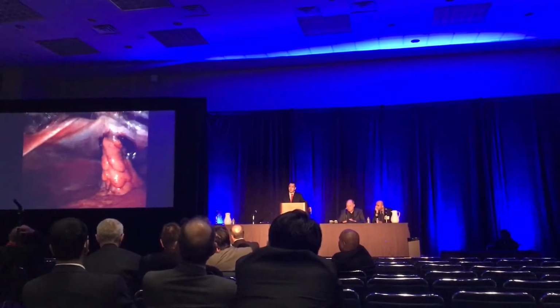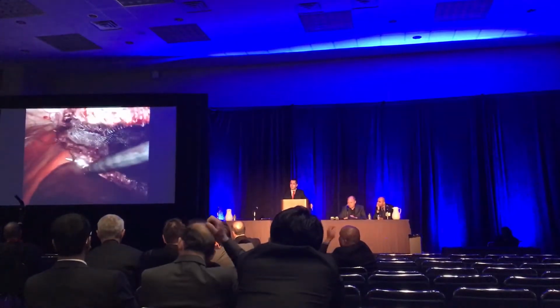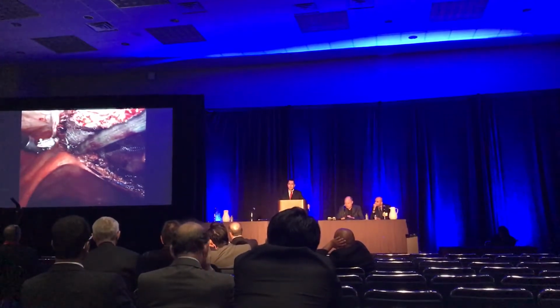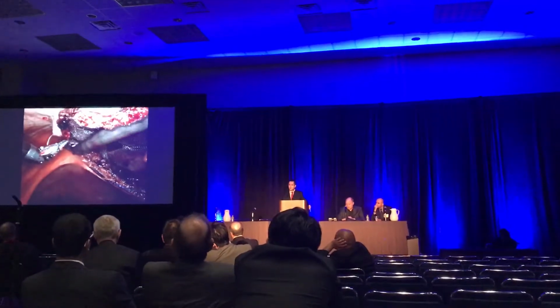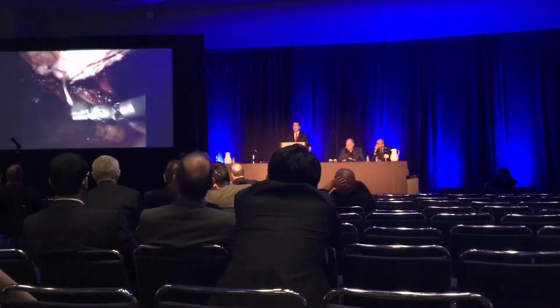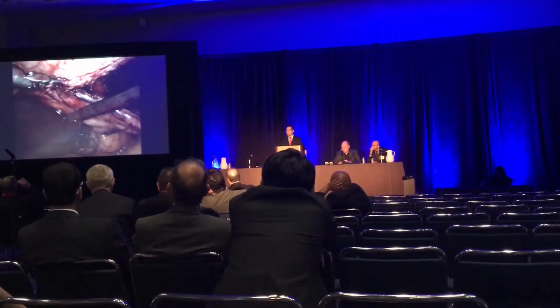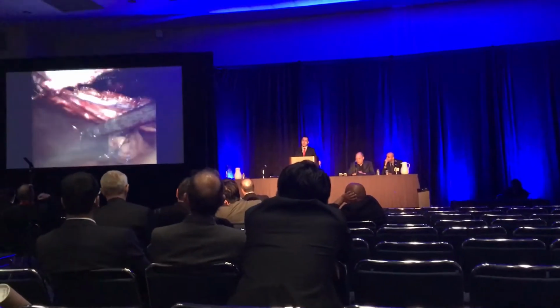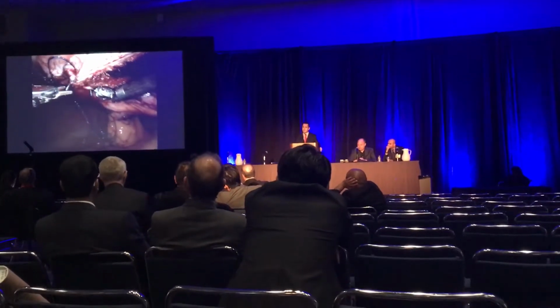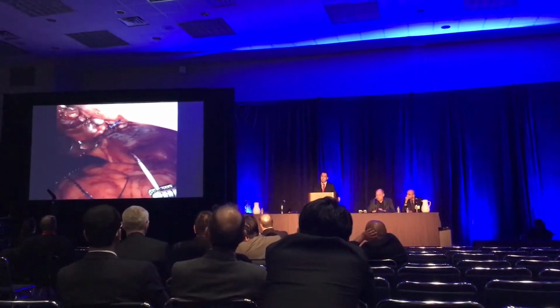The last step is to close the defects created to enter the retrorectus space and the hernia defect. This is done in a running fashion with a braided absorbable suture. This technique, even though it's more complicated than other laparoscopic repairs, we believe it allows for a sturdy repair, closing both of the defects and providing a wide coverage of mesh, and importantly, not leaving any foreign material in the abdominal cavity.